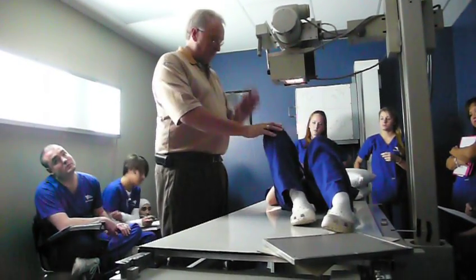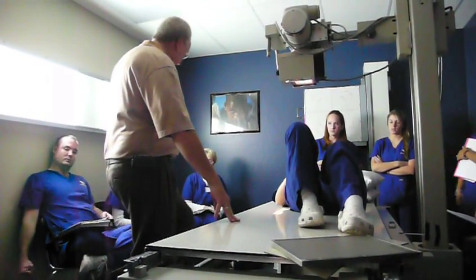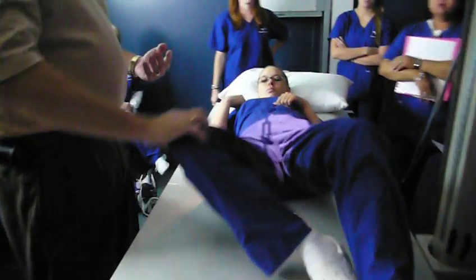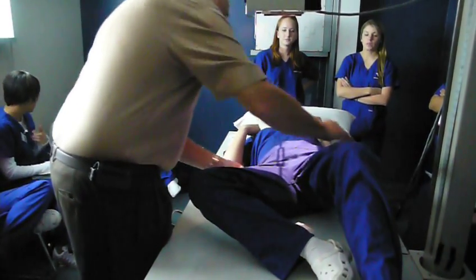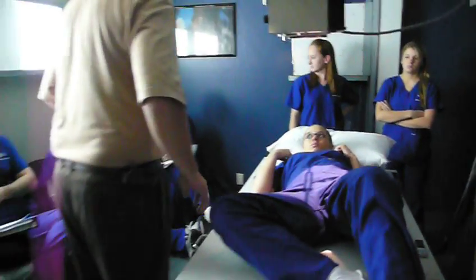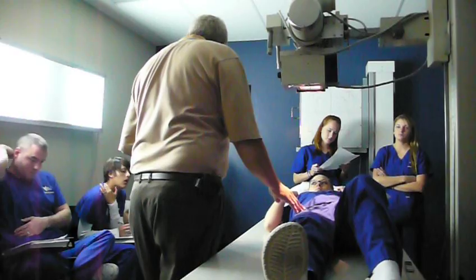Just a little trick I can show you: when you bend your leg up, everybody's got a crease right here. Look right where that crease is — central ray is right in that crease. On the lateral leg, your hip — yeah, in the lateral leg, even when I do the AP. Obviously you don't bend your leg when you do an AP, but it's at the crease.